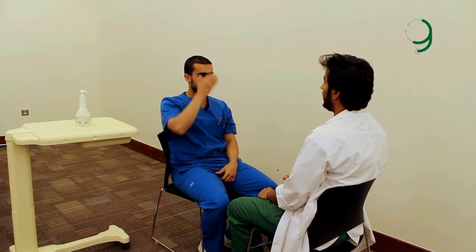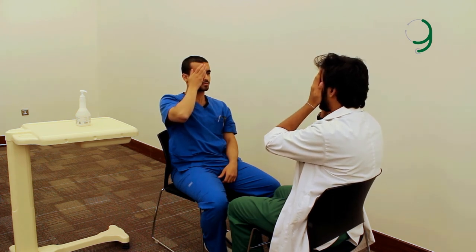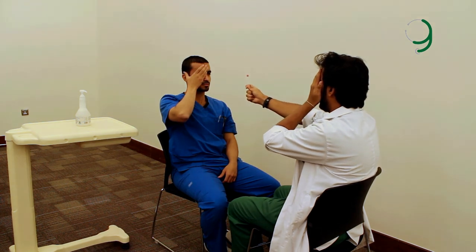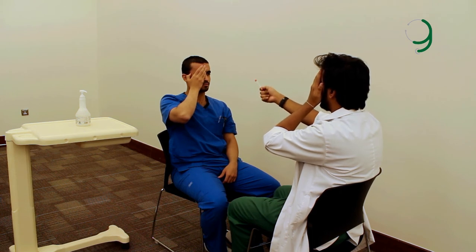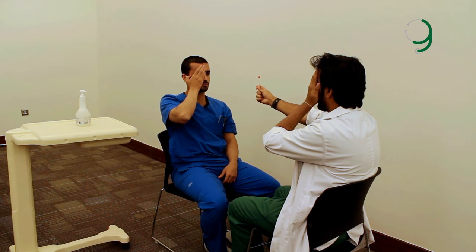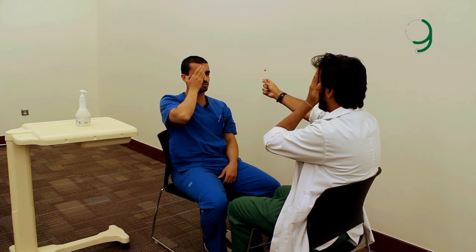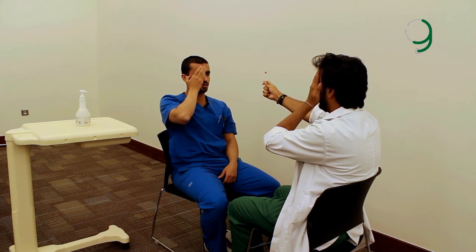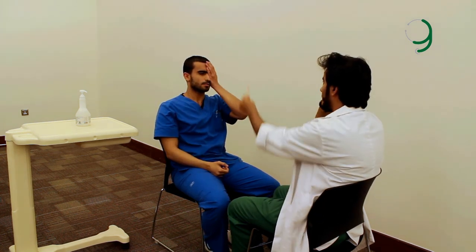Next is the blind spot test. The blind spot is tested by using the red pin — this is the red pin. Ask the patient to close one of his eyes, and you close the other. You keep the red pin between your vision and ask the patient to focus his gaze on your eye, and you do the same. Just move the red pin temporally until the patient sees it disappear. Tell me when you see it disappear. Then compare the blind spot to your own, and move it up and down to see when it comes back. Then do the other eye — close the other eye and do the same.